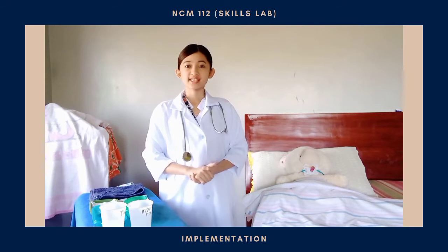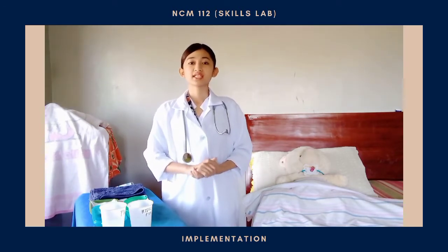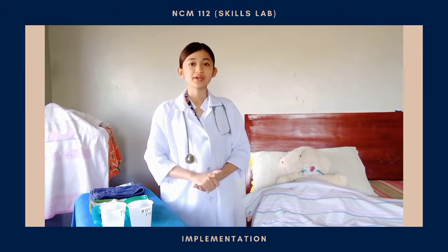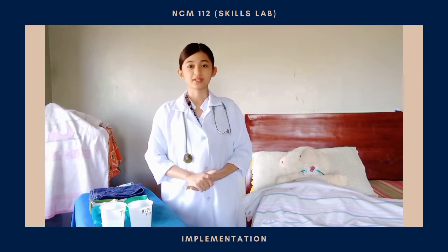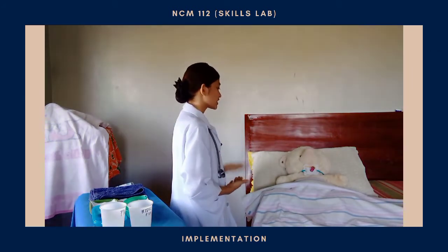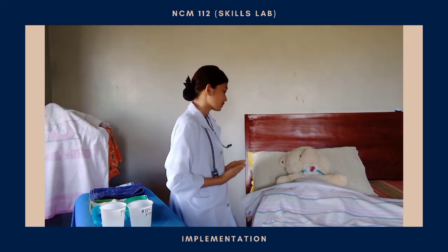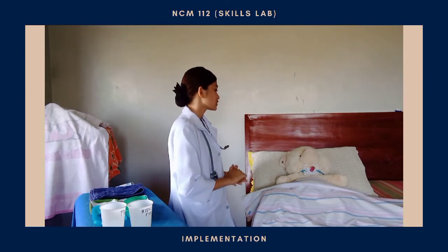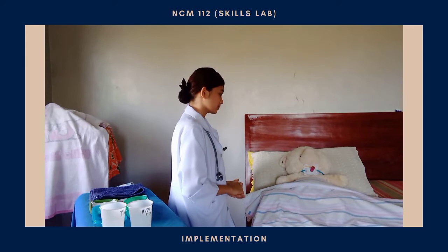Now that I have assessed the tracheostomy site and the client's pulse oximeter, explain to the client what you're going to do and the reason for it, even if the patient does not appear to be alert. So ma'am, I have assessed that the dressing in your tracheostomy is already wet. So now I will replace it and clean the site so that we can prevent any infection from happening.